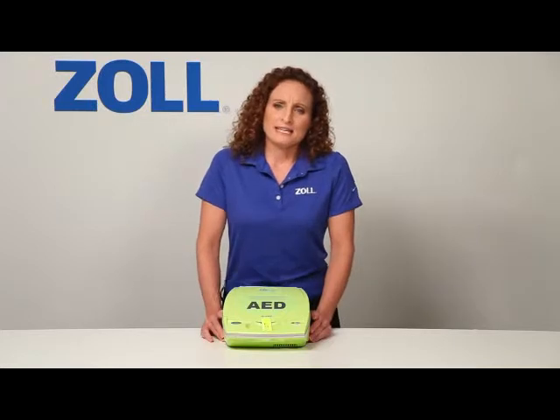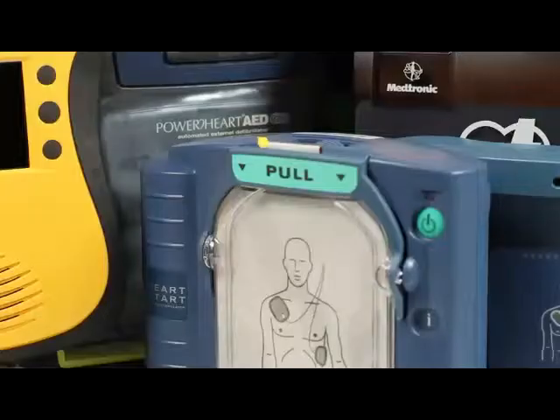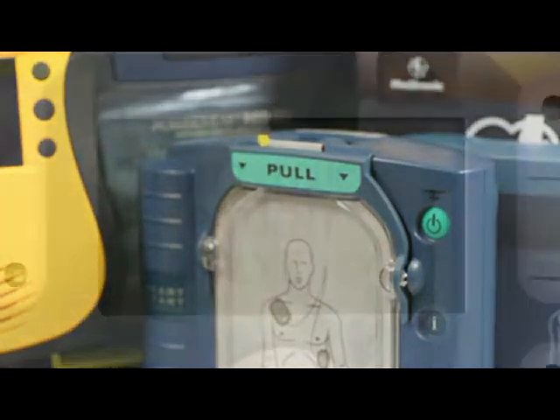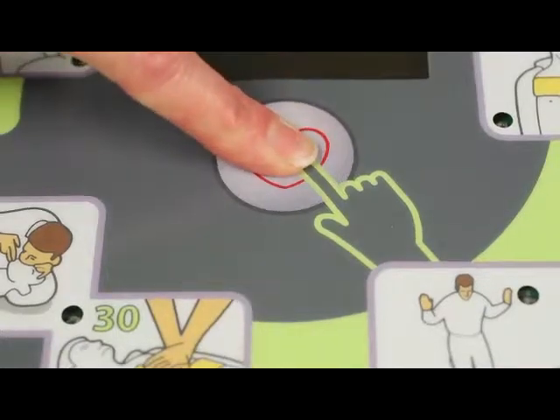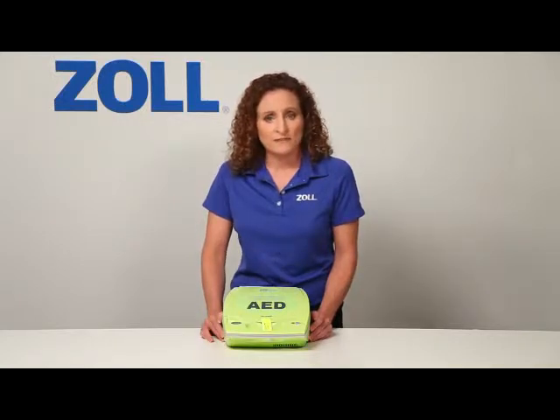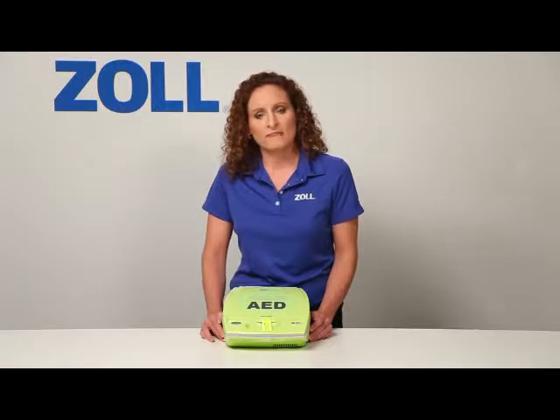Does that mean that half the time when you push the shock button on another AED, it won't deliver a shock? No. Other AEDs can shock just fine, and so can the AED Plus. Yet many people don't know this. Research shows that when an AED is attached to a victim of cardiac arrest, it will advise a shock only half the time.